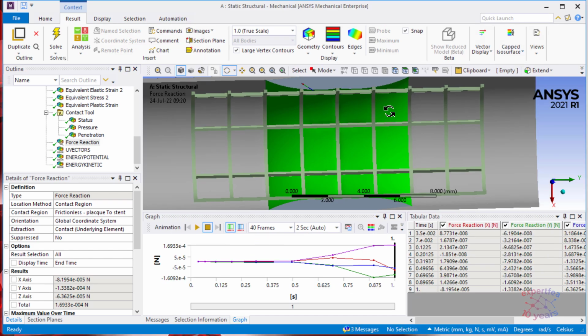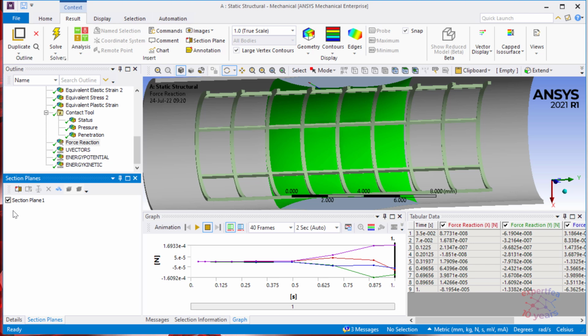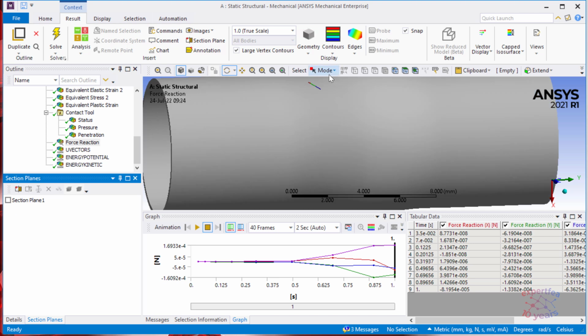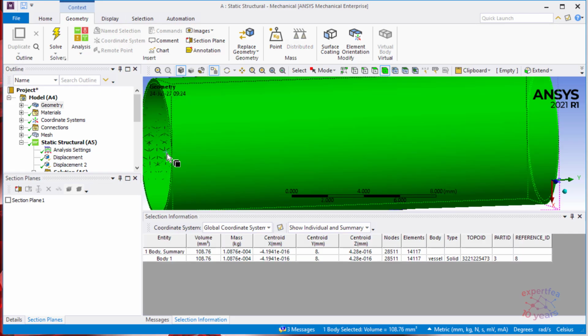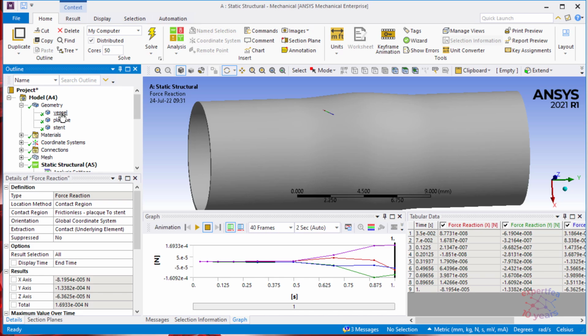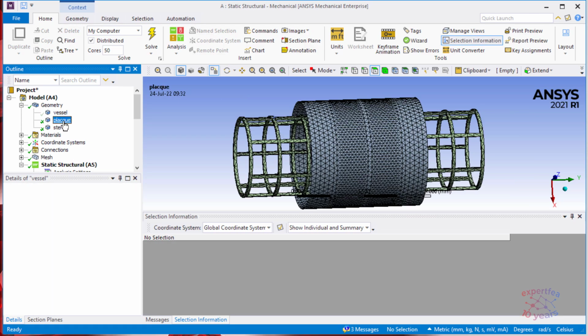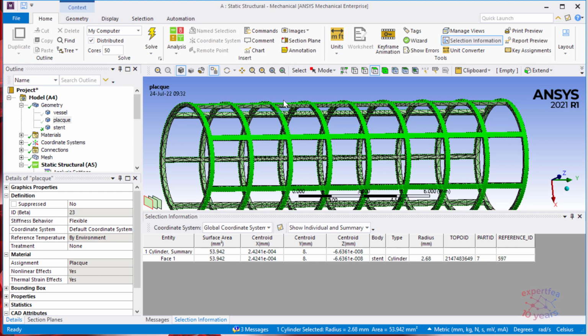This is pretty interesting. Let me show you how to find out this area. Let's get rid of the section view. What do we know? It worked now. Let's hide some of the parts. Select mode. Can I select them? Of course not. Let's hide what we don't need. Then if we select the outer face of the stent, we have here the selection information button, and we can see that the surface area is 53. I lost the previous calculation. Let's make another one.